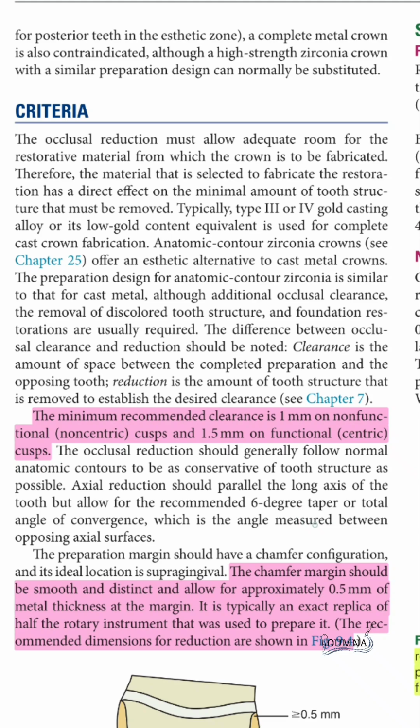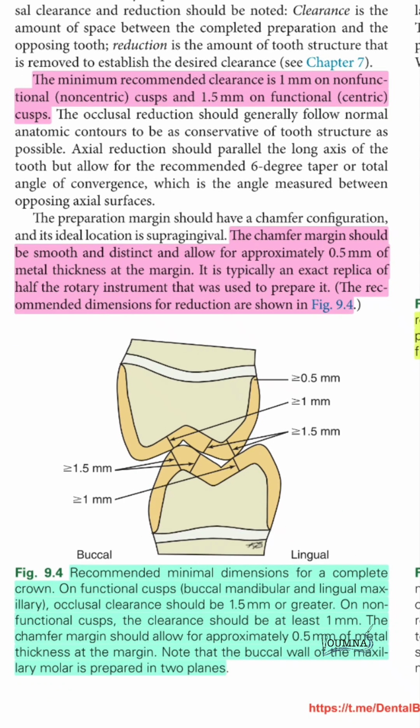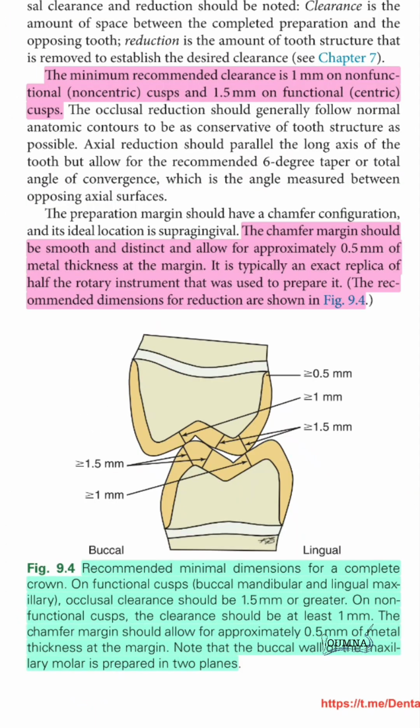Now let's talk about the criteria that should be present in the preparation of the complete crown. First, we must have a minimum clearance of 1 millimeter for non-functional or non-centric cusps, that are the mandibular lingual and the maxillary buccal, and 1.5 millimeters for functional cusps, that are the mandibular buccal and the maxillary lingual. Here we can see the reduction needed for the cusps. On this side we have 1.5 and 1.5 on the maxillary, and on this side we have 1 millimeter and this 1 millimeter.